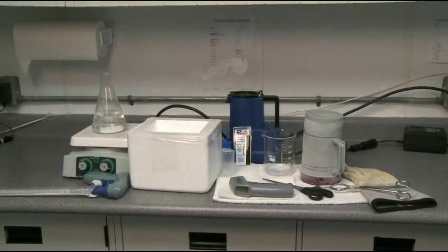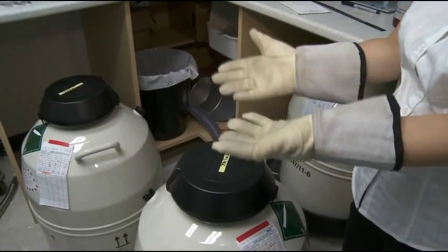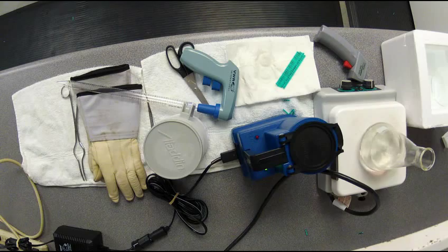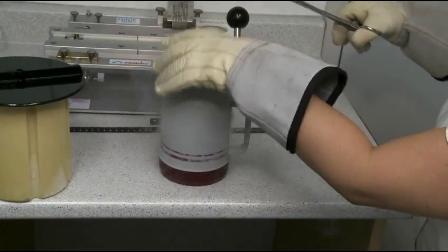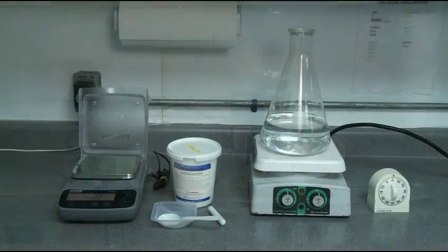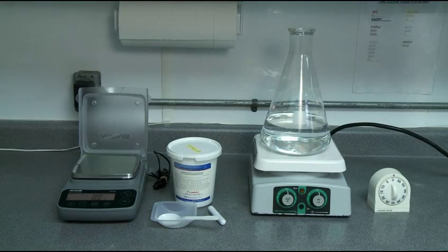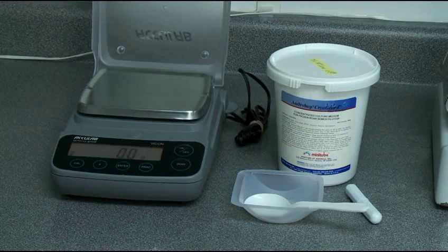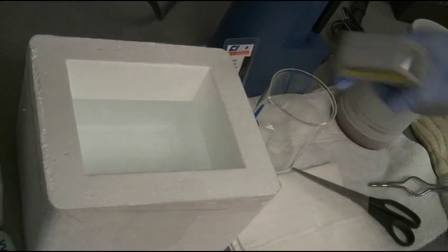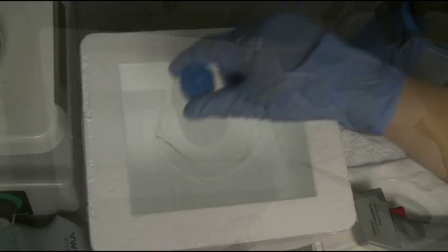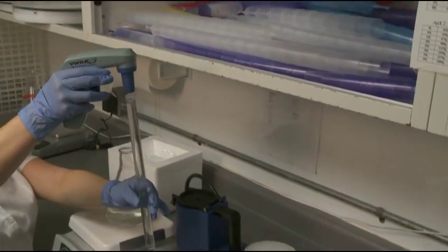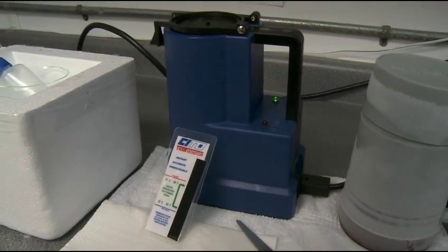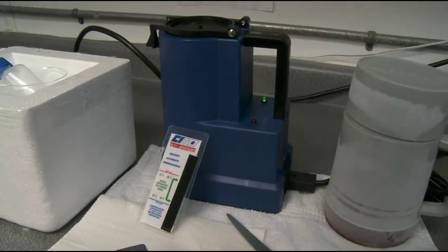Before you begin, make sure you have the following equipment available: protective gloves, forceps, transfer container, distilled water, extender cryo guard thaw, flask, scale, plastic tray, scoop, water bath, thermometer, semen bottles, pipette, beaker, scissors, CETO thaw unit and liquid nitrogen.